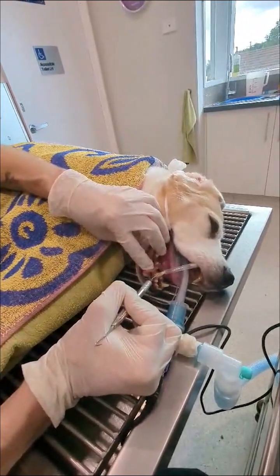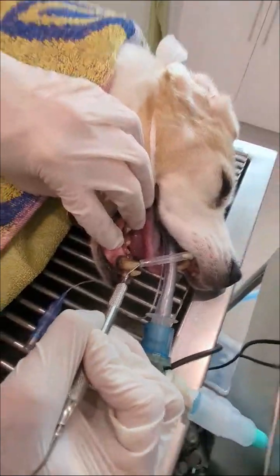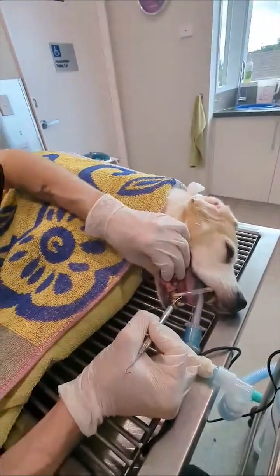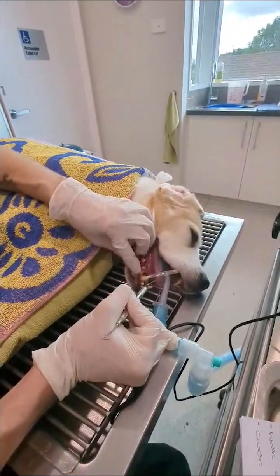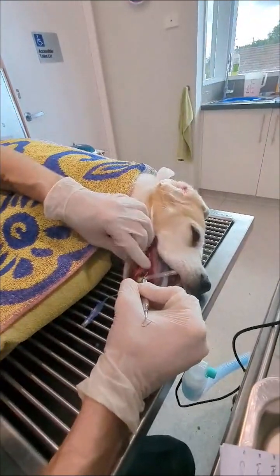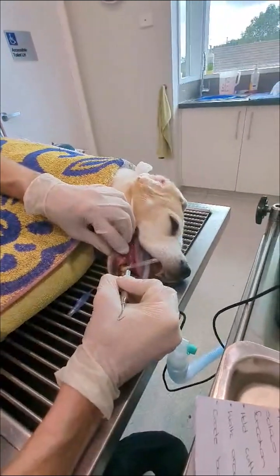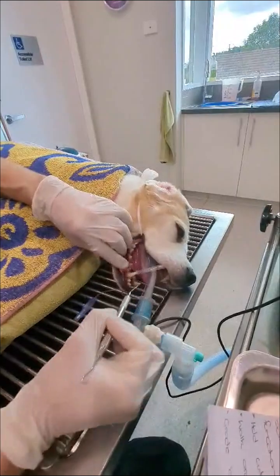Here, I can see quite a pocket depth of about 3 mils there, so I will just note that on the dental chart, and it's got a calculus grading of about 2 there. When you are grading the teeth, the vet will generally call out 2 numbers, the first being the calculus score and the second being the gingivitis score.